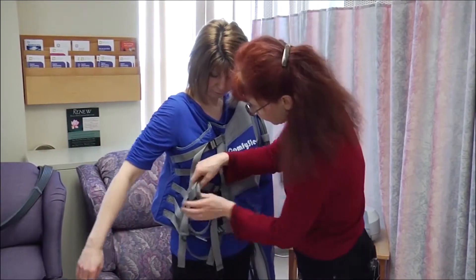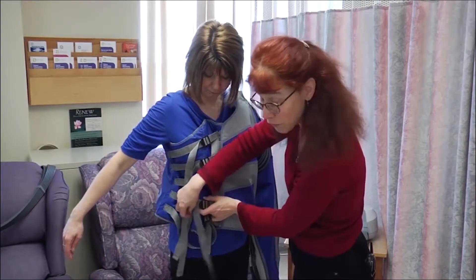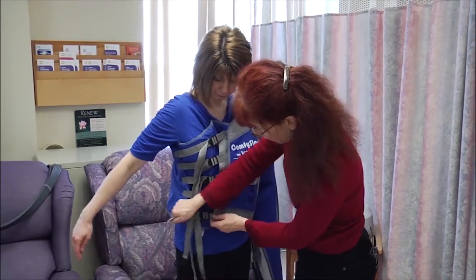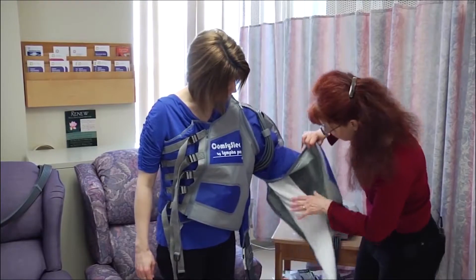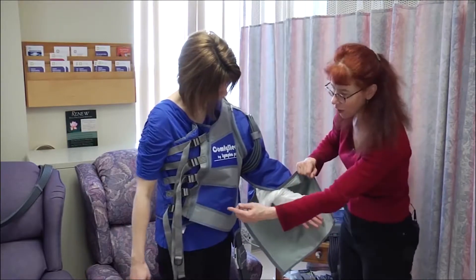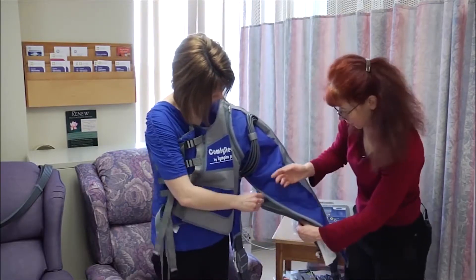This particular adapter is a little large for her, but the beauty of the appliance is that it will inflate to fit her even if it's a little loose. Now if she were doing this on her own, she would be able to use her hand, and at home she probably wouldn't have stockinette, so she would be able to operate the zipper with both hands. For treatment purposes, we're going to go ahead and zip this up.